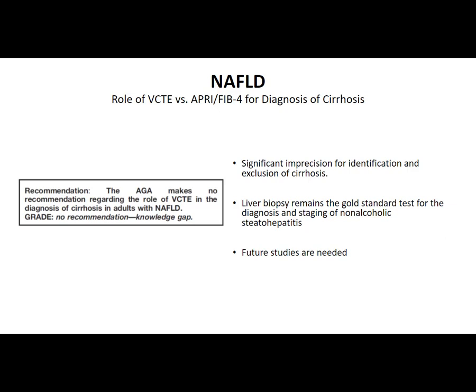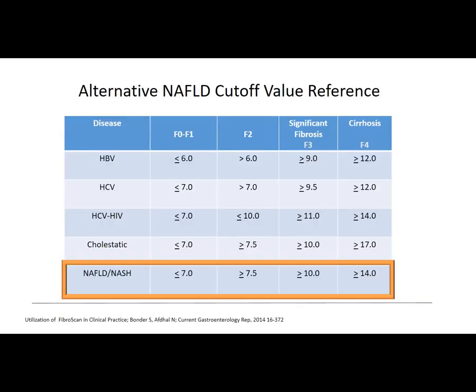Also, this study did not look at the CAP probe, by the way, the fat content in the liver, which clinically we find quite useful, but it was not FDA approved when we started this exercise in 2015, so we didn't include it in the guidelines.